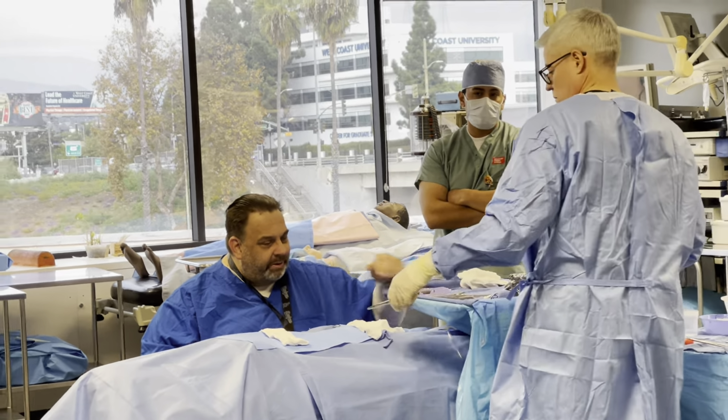Okay, once we finish up doing the abdominal cavity and close, we're on skin now. So we're gonna ask for a skin suture or skin stitch, plus we're gonna get what? Let's start with our pickups. What team? Adsons. Why Adsons? With skin, we start with Adsons, we finish with Adsons. Right. So now I'm closing up the skin.